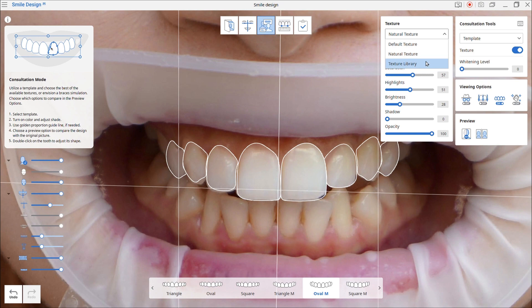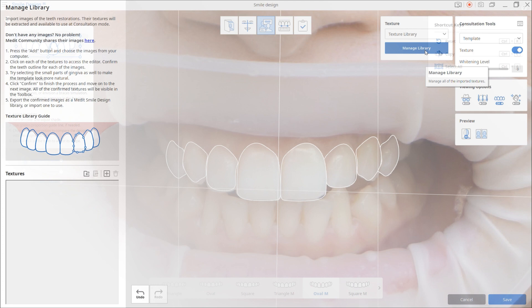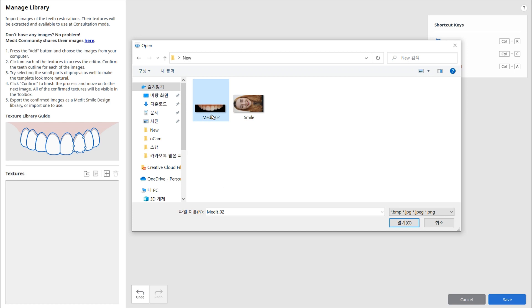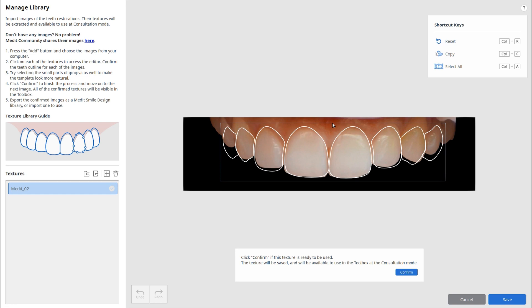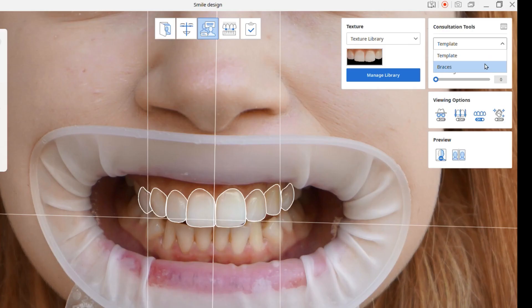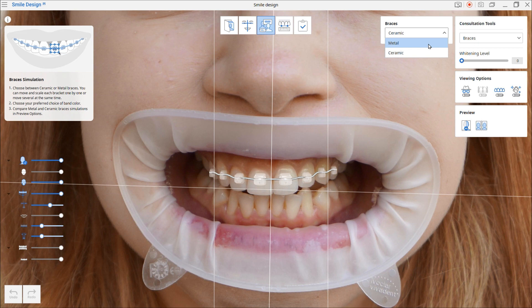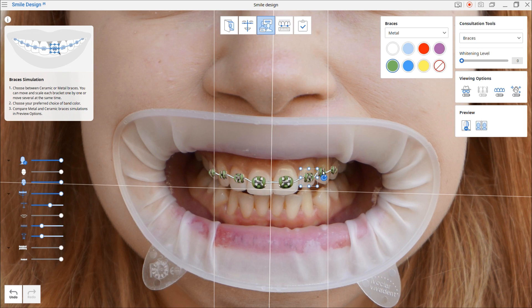Next is the texture library. You can import images of teeth restorations to extract their texture. Click the plus button to import images from your computer and register them to the texture library. Next is braces — you can choose between metal and ceramic options. Like the template simulation options, you can move the braces around and determine their location. Lastly, there is teeth whitening, which shows what the teeth would look like when whitened. Use the various simulation options and see before and after in preview.